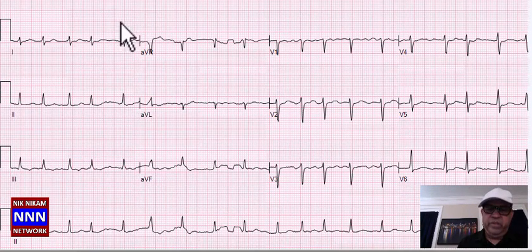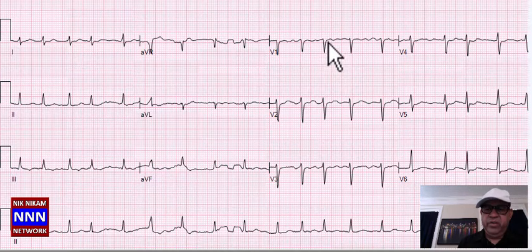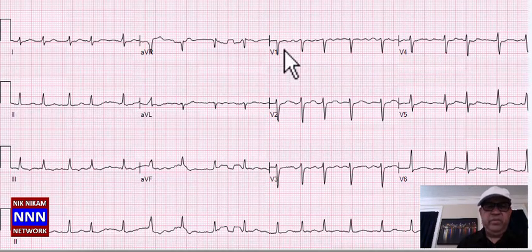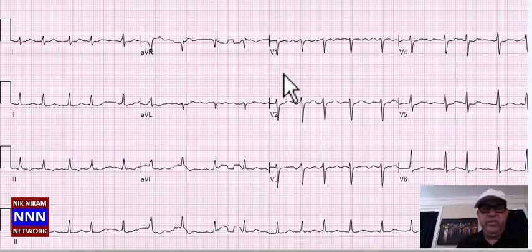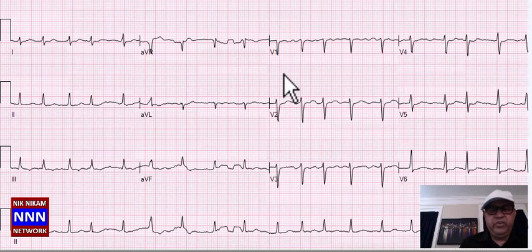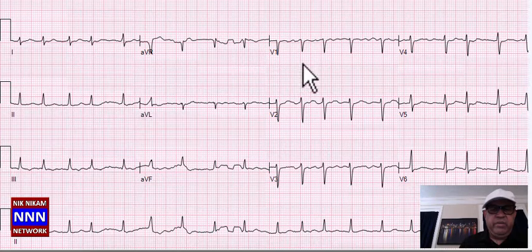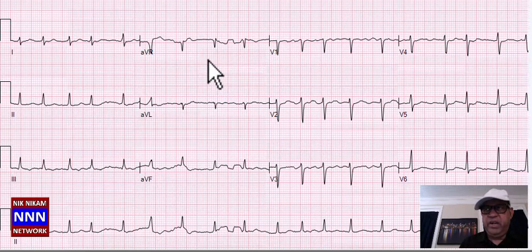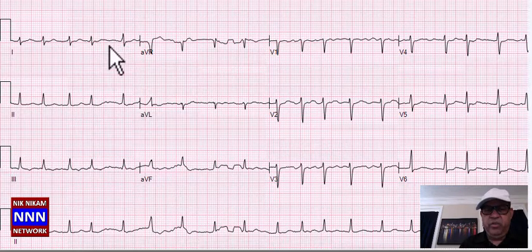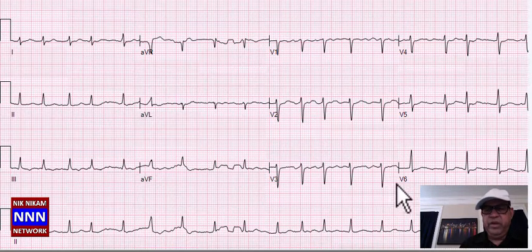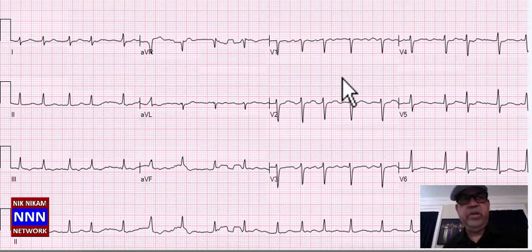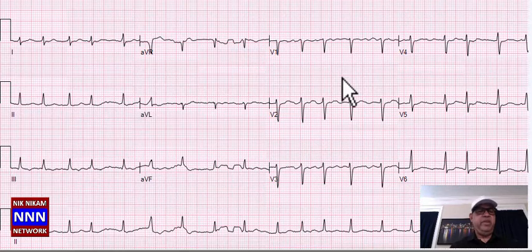This is atrial fibrillation — RR intervals varying and fibrillatory waves in lead V1, along with low voltage. There is also loss of R-wave progression in the anterior leads, suggesting underlying conditions such as coronary artery disease. It could also be a patient with chronic lung disease showing low voltage, loss of R-waves, and non-specific ST-T changes. That's how we try to detect the patient's overall medical condition by looking at the electrocardiogram.